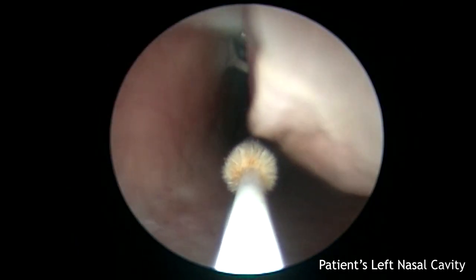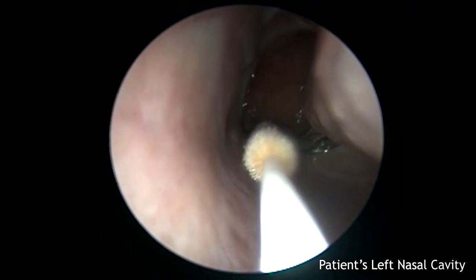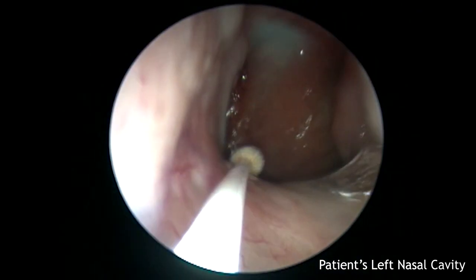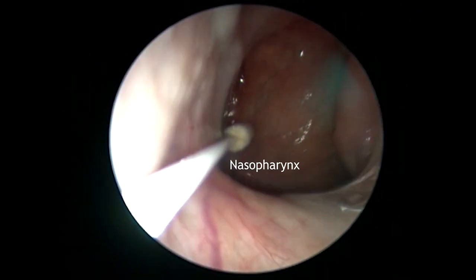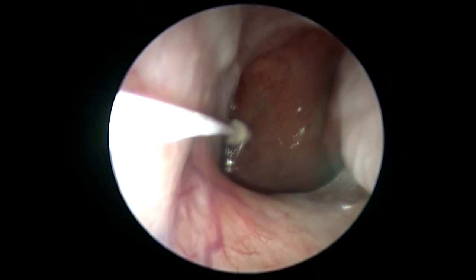Insert the swab until the nasopharynx is palpated. You will feel soft resistance roughly six centimeters posterior to the nasal inlet. Applying gentle pressure while rotating the swab can help reach the nasopharynx. Once in position, rotate the swab for five seconds to collect secretions.